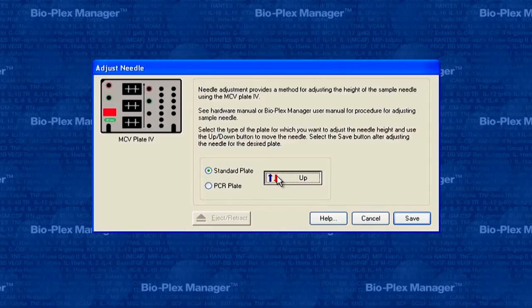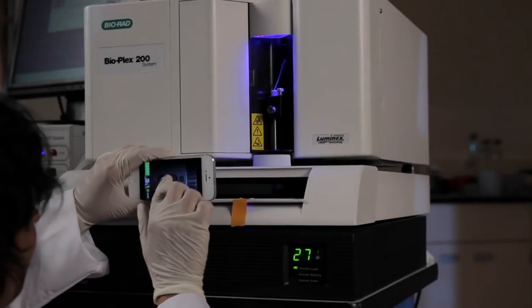Now, click the up-down button in the Adjust Needle dialog box to move the needle up and down.